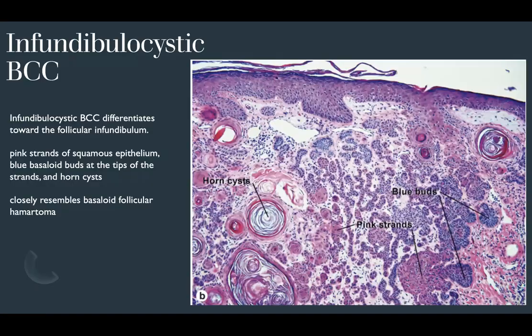Infundibulocystic BCC — sometimes called adenoid BCC — has a basal cell carcinoma with very thin pink strands surrounded by basaloid staining, areas of blue basaloid budding, and some horn cysts. It resembles a reticulated seborrheic keratosis and BCC cross. BerEP4 will highlight the islands in an infundibulocystic BCC but be completely negative in a reticulated seborrheic keratosis. This subtype indicates differentiation towards the follicular infundibulum. It closely resembles basaloid follicular hamartoma, so BerEP4 positivity and cellular pleomorphism with areas of infiltration favor the BCC.